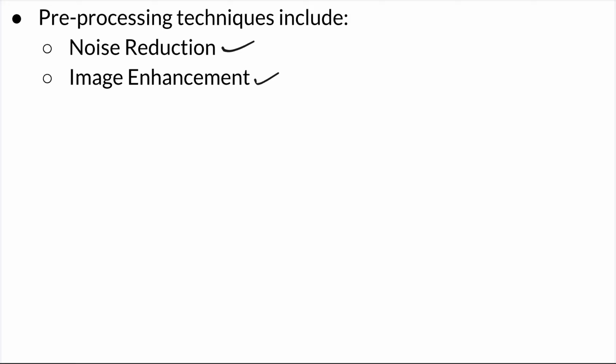All right, so when you're reducing noise, as I said, this one is actually not an image processing course, where you look at the mathematics and all sorts of things. Because this one I'm just attaching to AI, I decided not to go deeper into this. You want to reduce the many noises that you have: speckle noise, salt and pepper. There are different types of noise that you need to find a way to remove.